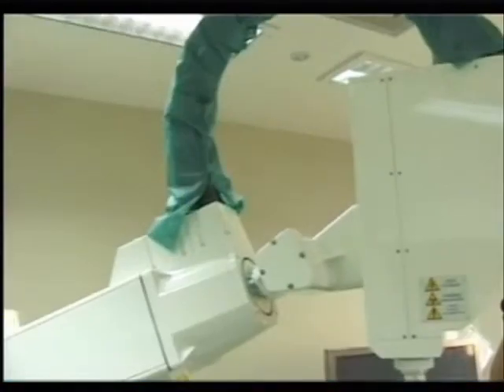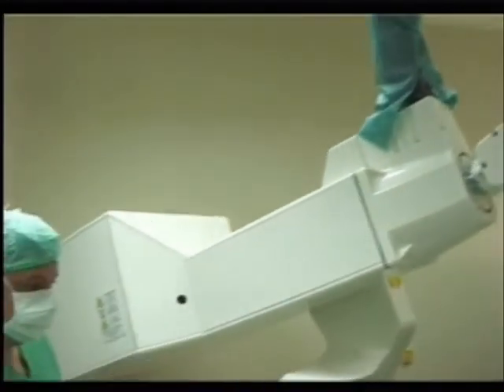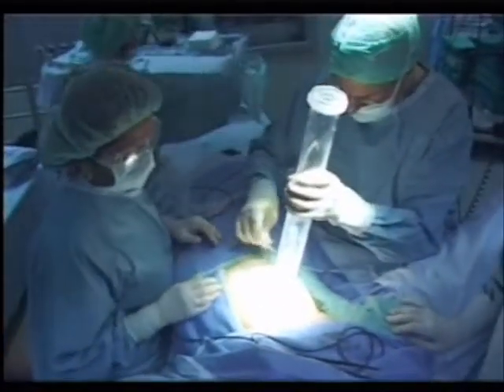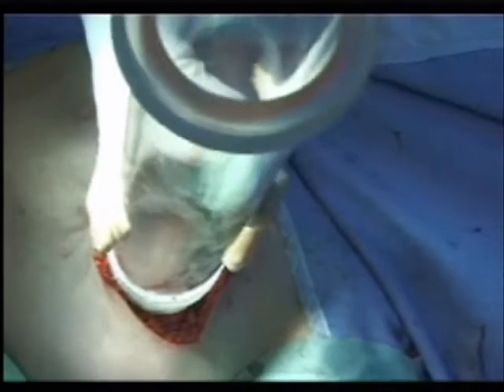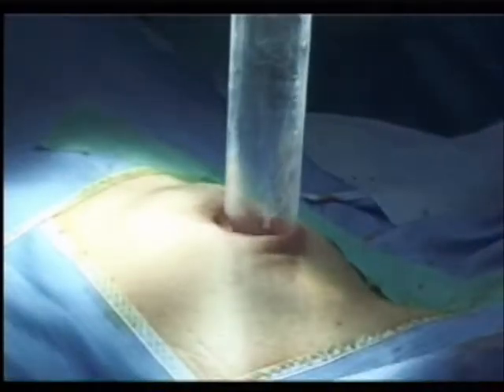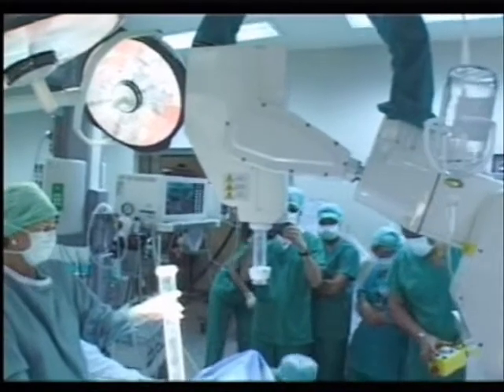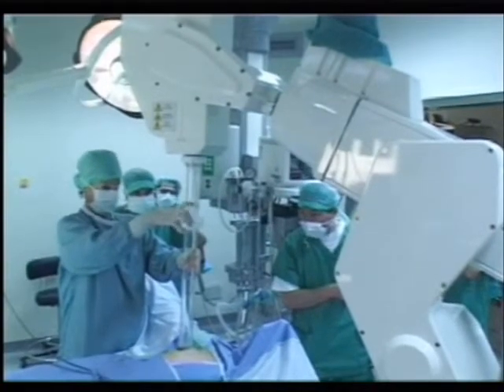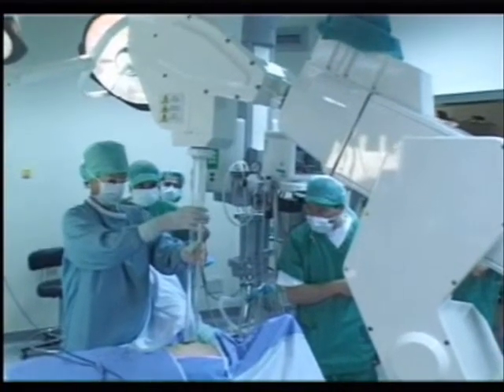Intraoperative radiotherapy is a procedure that allows the administration of a single high dose of radiation on a directly exposed tumor target during surgery. It is a selective technique that allows the accurate and precise identification of the target volume to irradiate, so that the surrounding normal tissues, which are usually mobilized away from the radiation beam or appropriately shielded, are spared from irradiation. This method makes it possible to administer a higher radiation dose, thus increasing local control while keeping toxicity at very low levels.